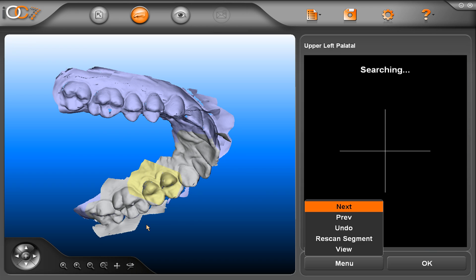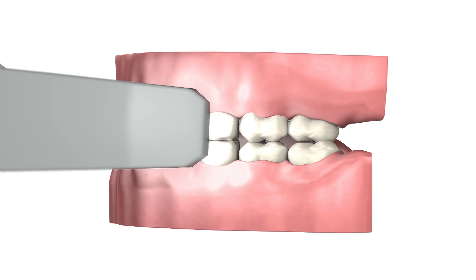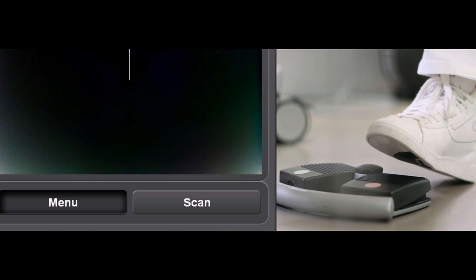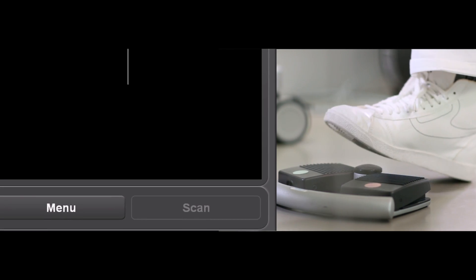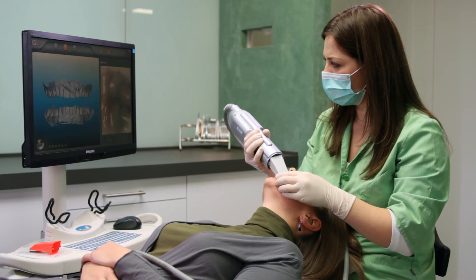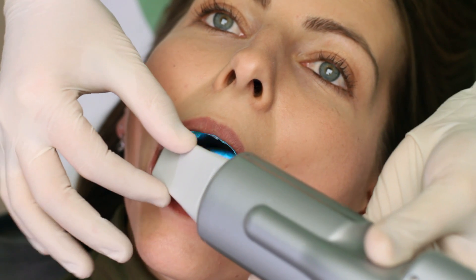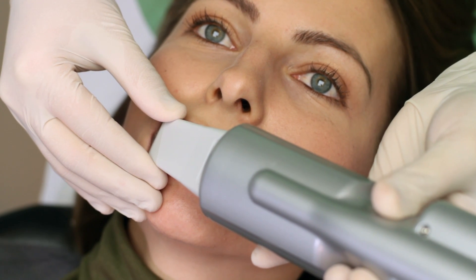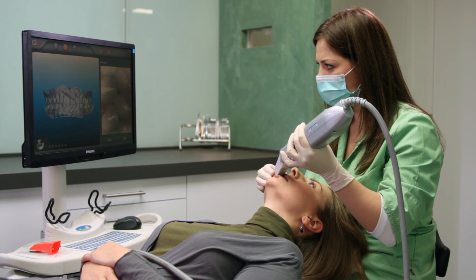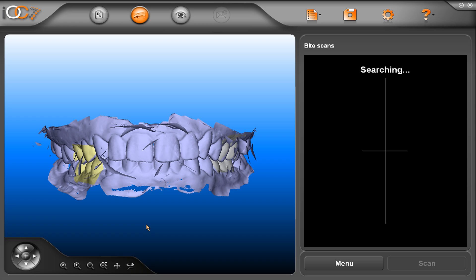After completion of the upper arch, proceed to scan the bite. Press the pink foot pedal and then the green. The system will ask to capture the bite from anywhere in the scan. Please capture one scan on the left side — you will see the occlusion comes together. Then capture the bite on the right side. Ideally, take the vertical line to follow the occlusal plane with an equal amount of the upper and lower. Then press the pink pedal followed by the green to enter view mode.